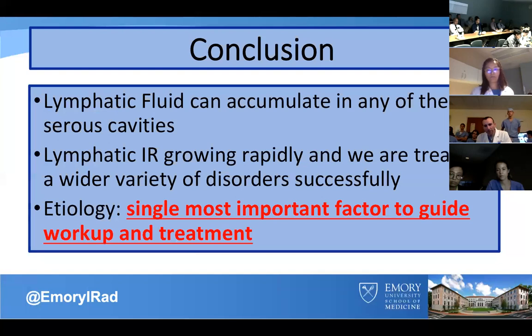As far as a little more technique, you're going to do your time-resolved sequence, whether it's Mobitrak or Thrive, or whatever lingo you want to use. It's going to look a lot like an MRCP, and you're just going to see this marching contrast. That one sequence is the most important, just going to show the flow dynamics. That's what we want to see. We get flow dynamic data from MR lymphangiography with better sensitivity than we'd have from conventional lymphangiography. So it really helps us with procedure planning.